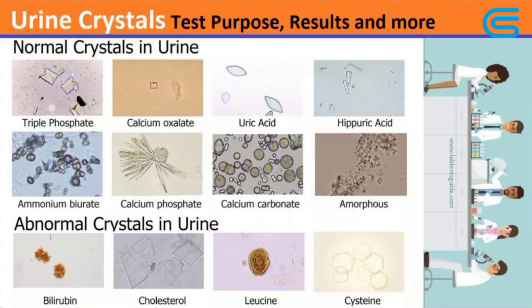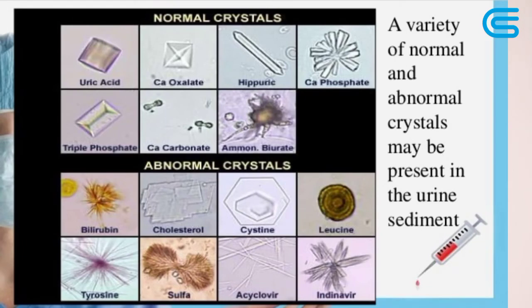Also organized substances include casts, hyaline or granular casts, bacteria such as Pseudomonas and Proteus, and parasites, spermatozoa, significant in males, yeast cells such as Candida albicans, flagellates such as Trichomonas vaginalis, which is also called the dancing ballerina girl, which causes vaginitis or urethritis.